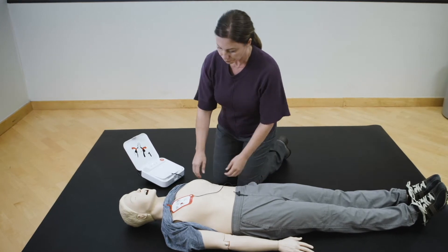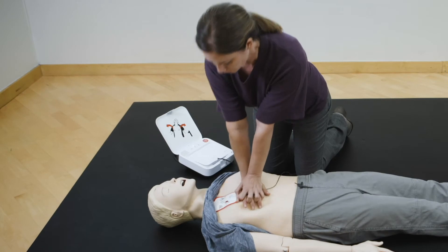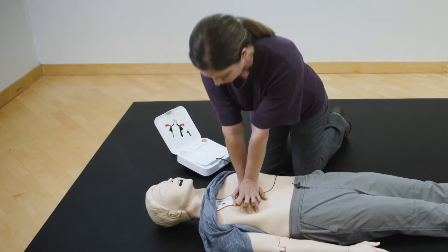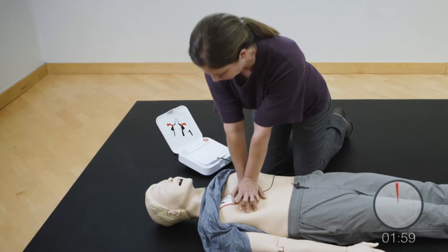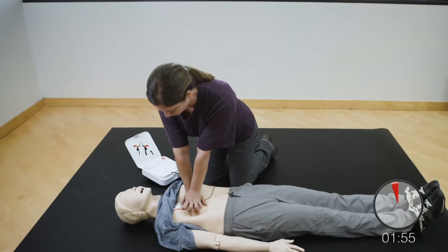Provide chest compressions to the beat. The heel of one hand should be in the center of the chest. The other hand should be on top of the first hand. Push down hard at least two inches.